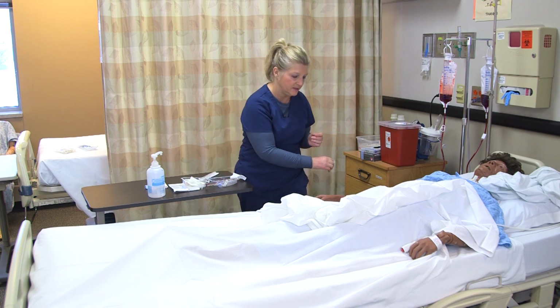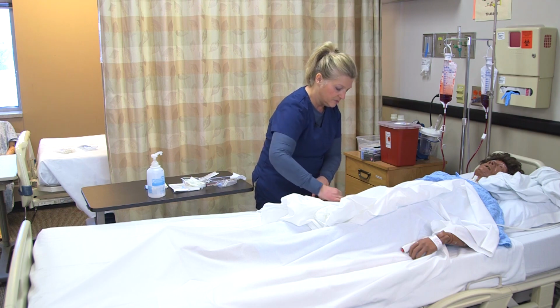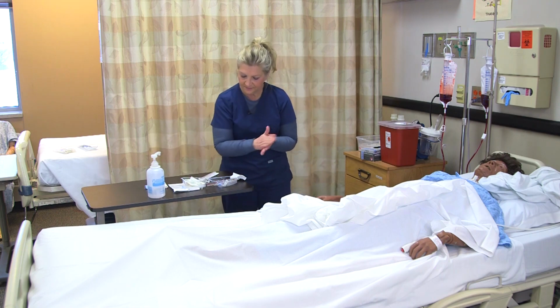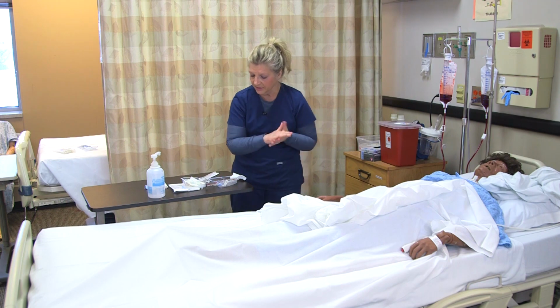So with the chlorhexidine, I squeeze to activate it, and I'm going to go ahead and do my cleansing. And I'm going to let that dry. And as I'm letting it dry, I'm just going to make sure that I have everything that I need.